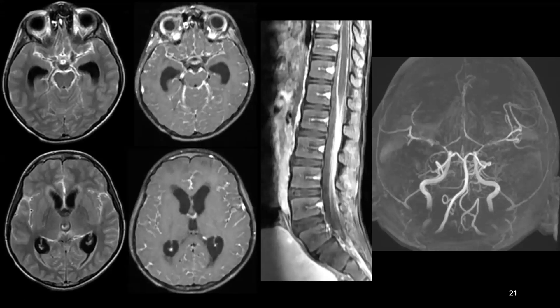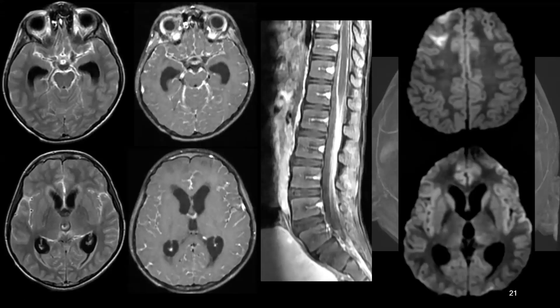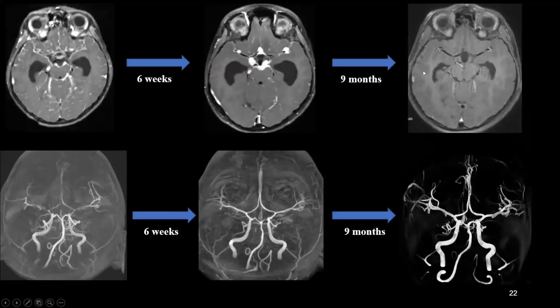This happens with all meningitis in the acute phase — you find the vessels in severe spasm. On diffusion imaging, you don't see much as on the TOF MRA, but there is a watershed infarct in the right ACA-MCA territory.